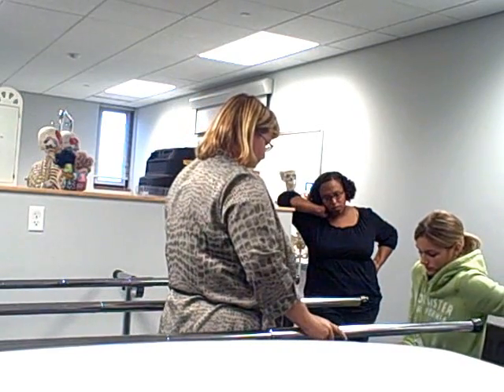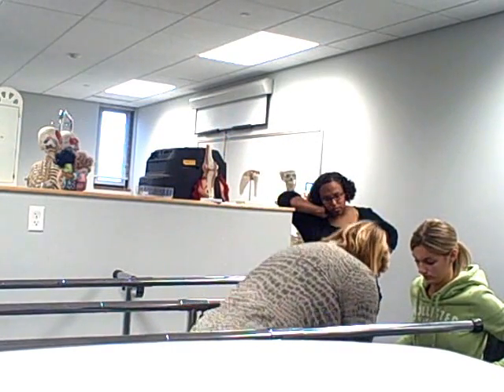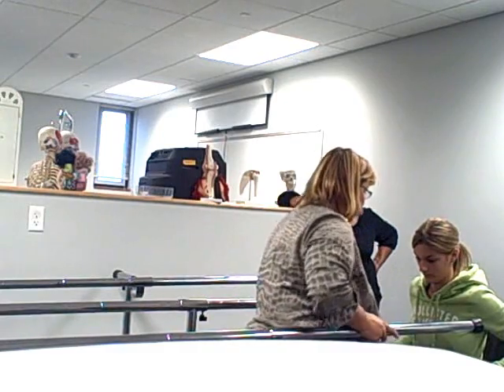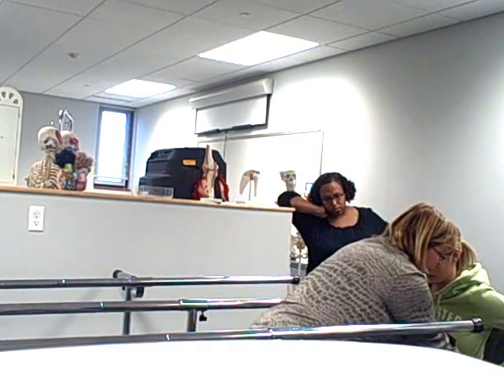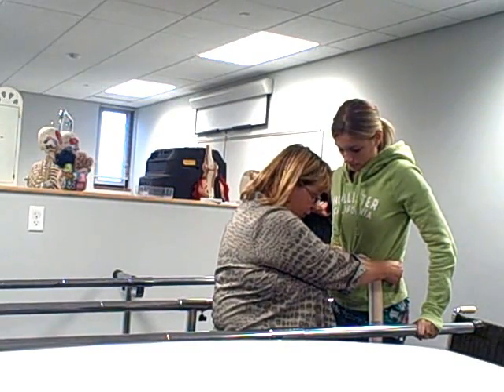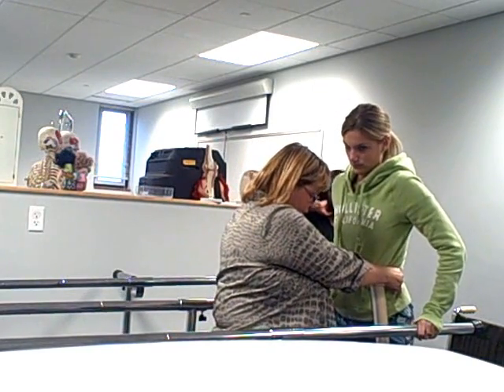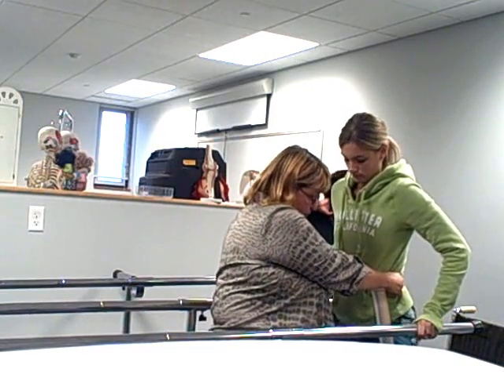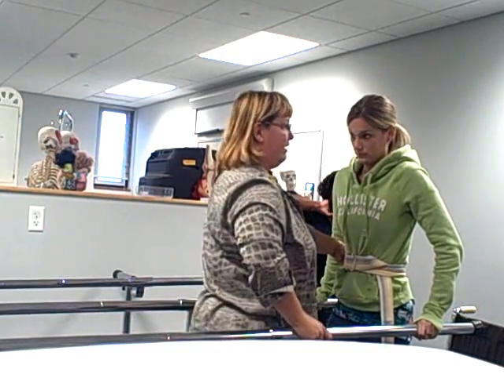Let's go ahead and scooch forward. So this is your non-weight-bearing leg — go ahead and put that leg out forward. Once we stand up, remember no weight on that leg. I'm going to have you bring this leg back just a little bit. We're going to go on three — you can put your hands here; if you can do it down there, that's even better. One, two, here we go. Beautiful. I'm keeping my knee blocked there — I can back off a little bit, but if she started to go down, I can push her back. So I'm going to have you do just a couple of squats. She's proven herself to me — I know she can lift her body weight up with that strong leg.